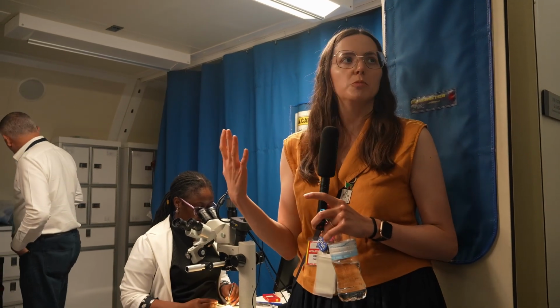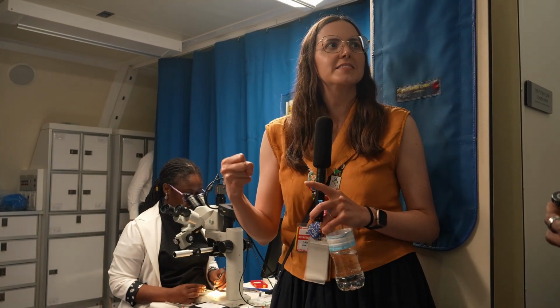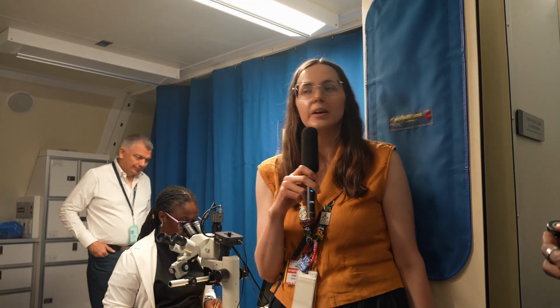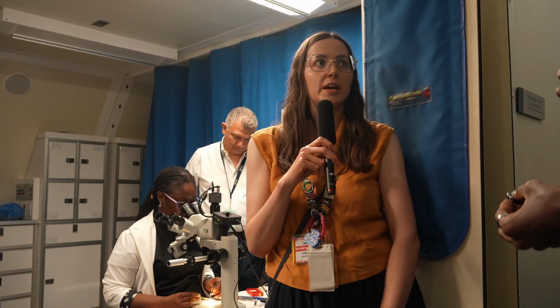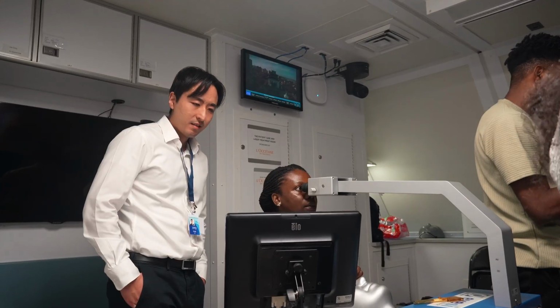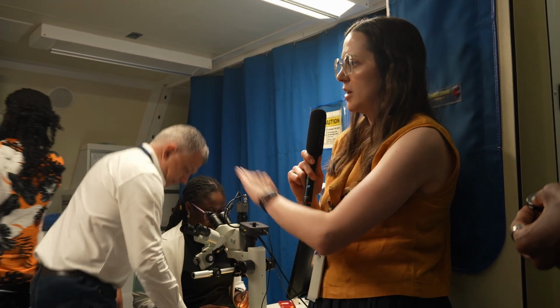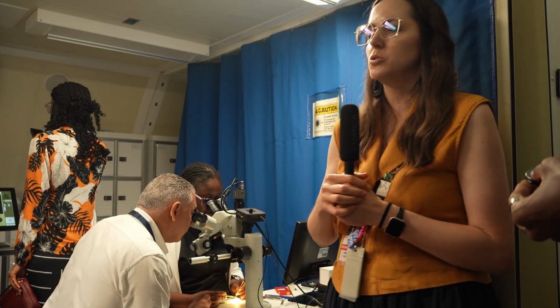Many of you might be familiar with how when pilots are learning to fly, they first practice in simulators, right? They're building those skills before they ever take off from the runway. There are similar concepts in medicine. So we have simulation training happening this week, which allows our participants to build those skills in a safe environment through things like this machine here, where you can see they're practicing cataract surgery. We have some other procedures happening throughout this week to practice in that way. So that's one purpose of this room.